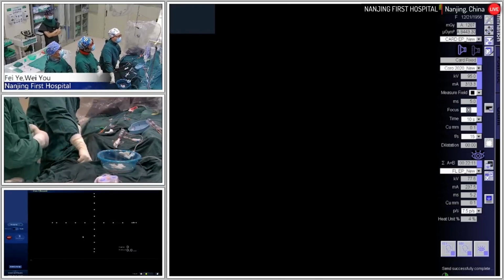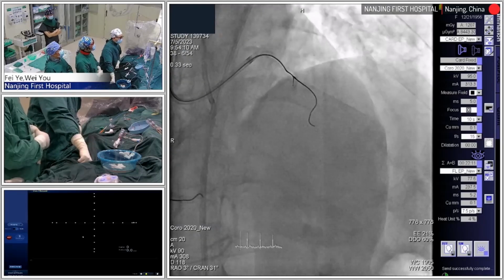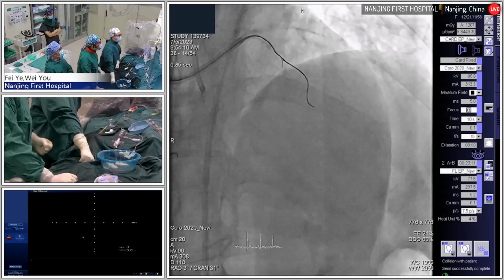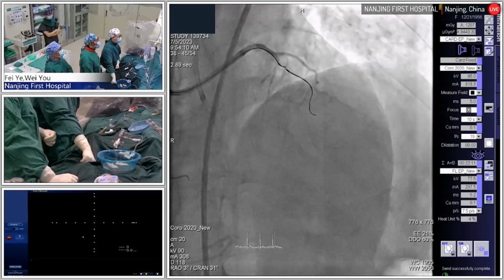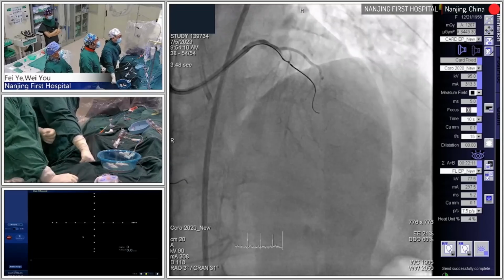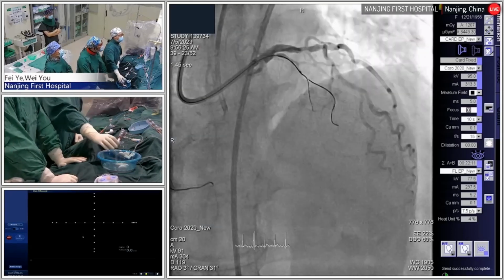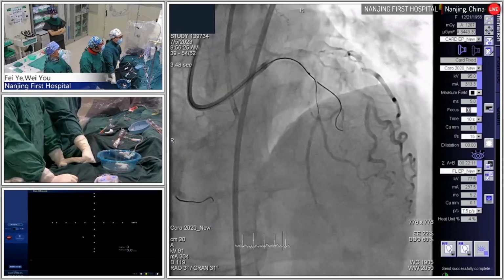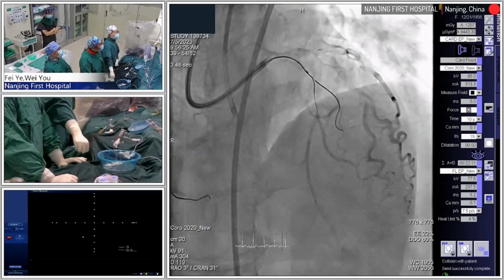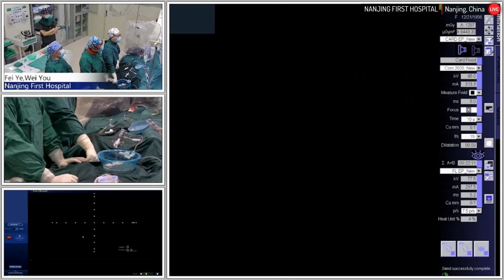So next, please. I tried to use the double lumen catheter, the KDL, but you can see the softer tip wire, Fielder XT, cannot engage the ostial plaque. So next, please. I changed the guide wire, and used a middleweight tip load guide wire. Seems better. Okay, next, please.